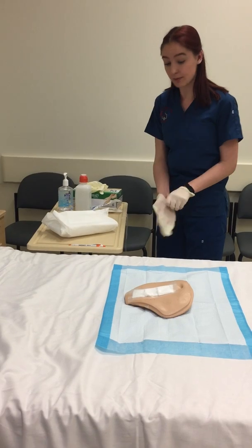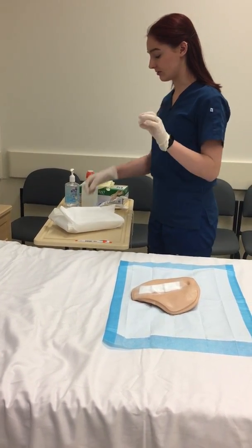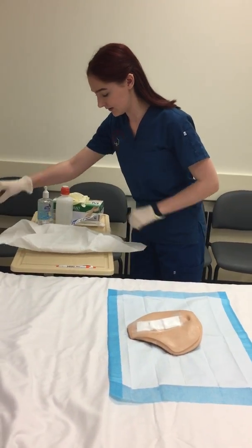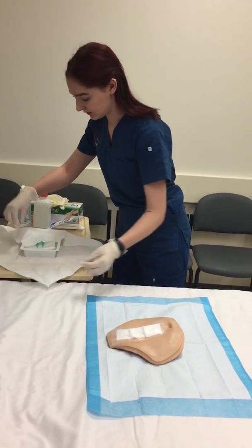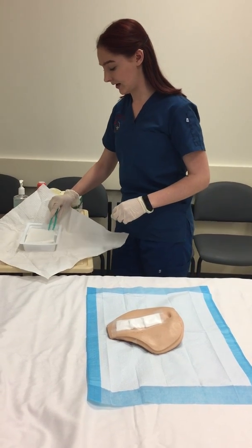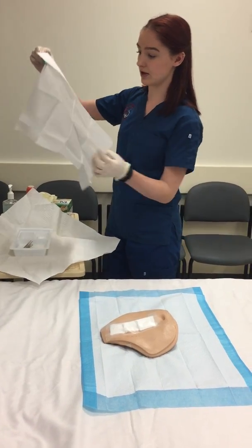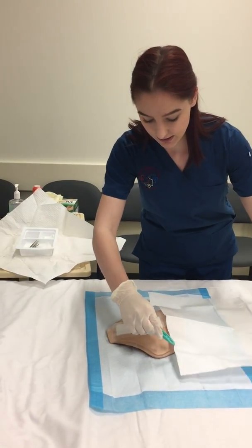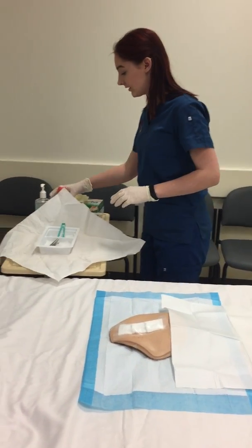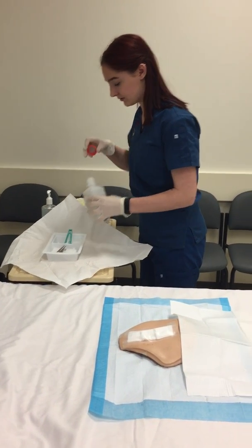So that I can then set up my tray just prior to changing the dressing. So I'm just going to touch the outside edges so that this remains sterile. And there we go. And then I can use my forceps. And I'm going to take this sheet here, and this is going to overlay my patient, just like this. And then I'm going to put these back in as these are sterile, and then I'm going to put some normal saline in my container in preparation for cleaning the wound.